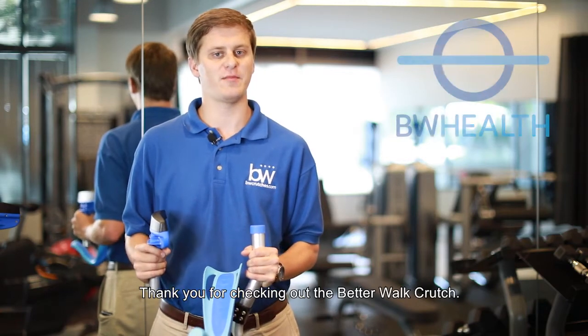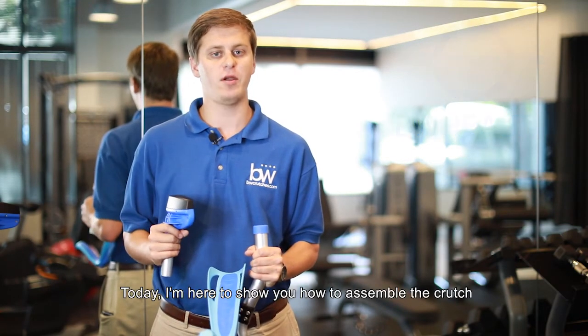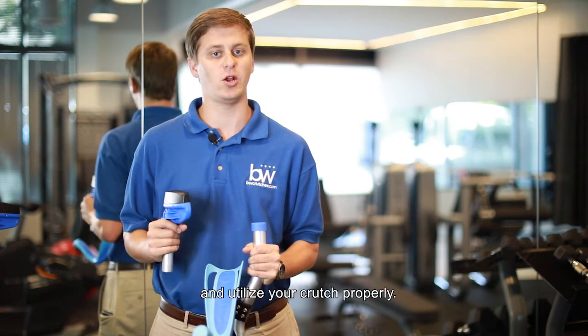My name is John. Thank you for checking out the BetterWalk crutch. Today, I'm here to show you how to assemble the crutch and utilize your crutch properly.